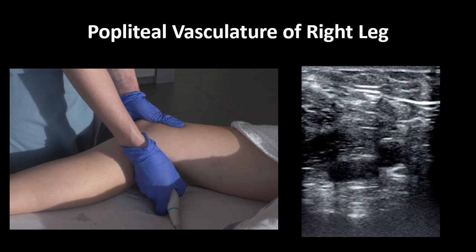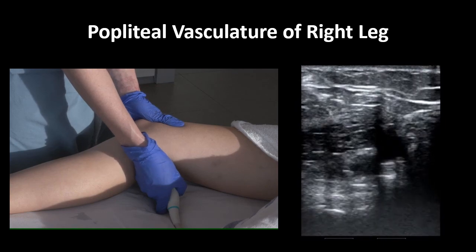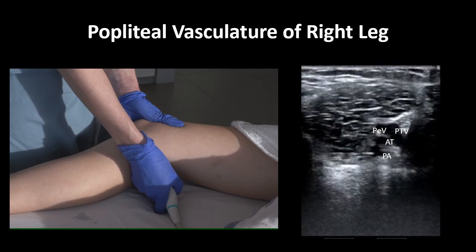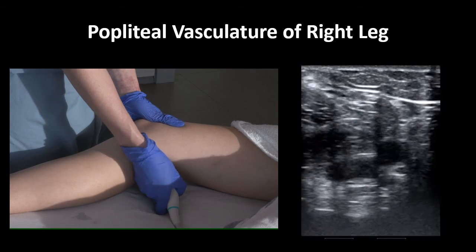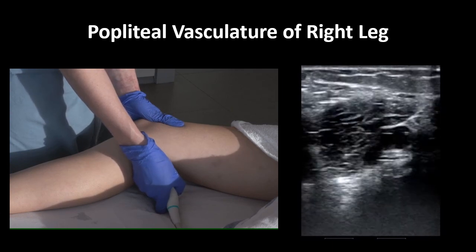Let's see what it looks like on ultrasound. Focus first on the pane on the right. The top of the ultrasound screen is skin, the bottom of the screen is the tibial plateau deep to the popliteal vessels, and our indicator is on the patient's right. Here we see the popliteal vein superficial and lateral to the popliteal artery. As the probe moves inferiorly, the popliteal vein essentially trifurcates in this patient into the three calf veins: the anterior tibial vein, the peroneal vein, and the posterior tibial vein. Again, notice what small movements are needed to scan through the relevant anatomy.